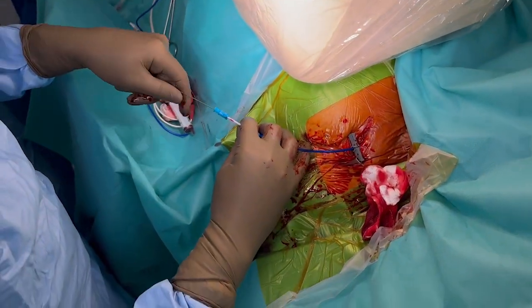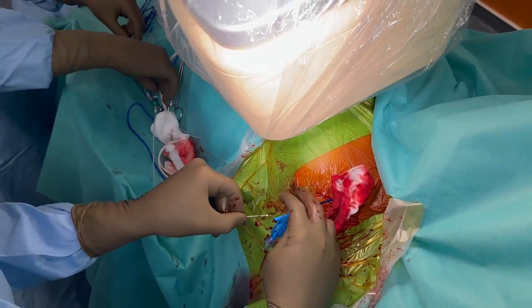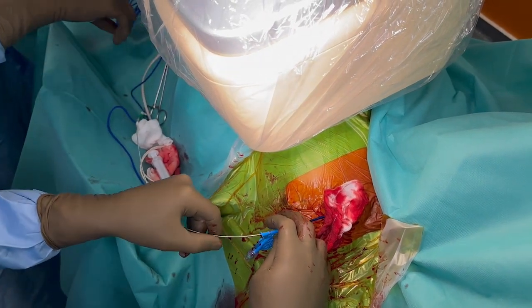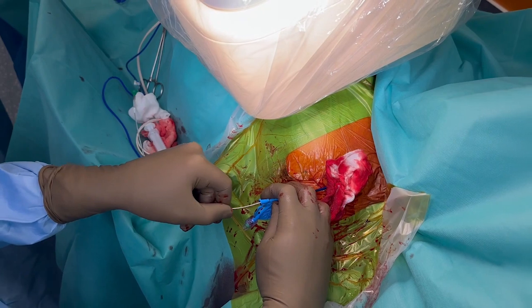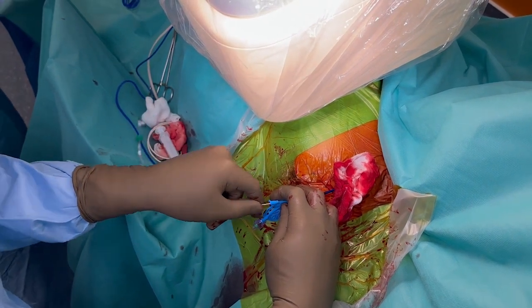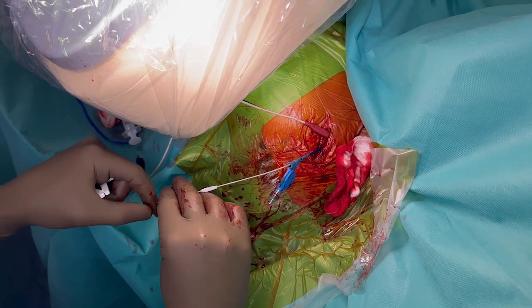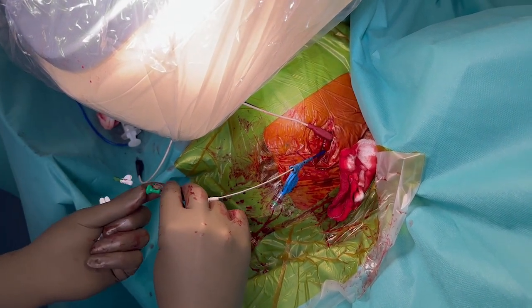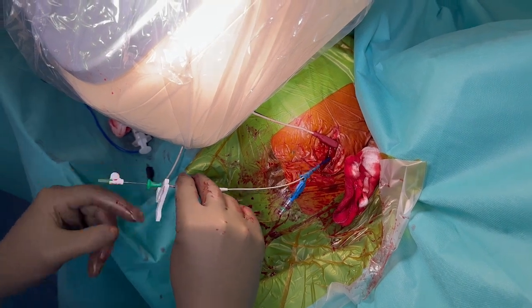We are now using the Biotronik HIS guiding catheter and the standard Solia S60 lead with extendable helix. In contrary to the 3830 lead with fixed helix, in leads with extendable helix good preparation is essential. Preparation may be either performed on the preparation table or, like in this video, within the guiding catheter.